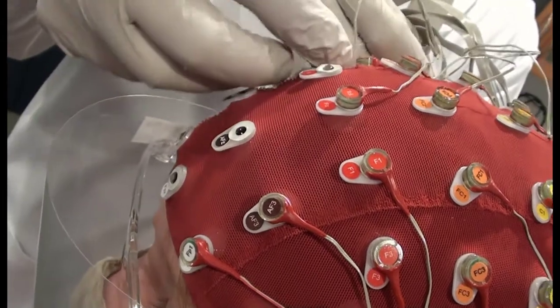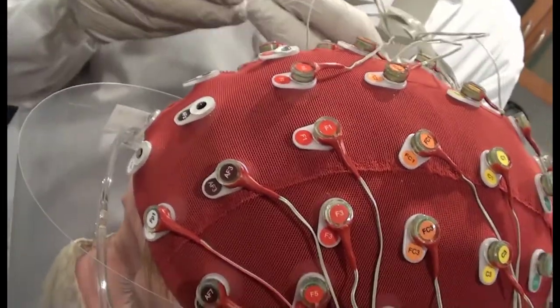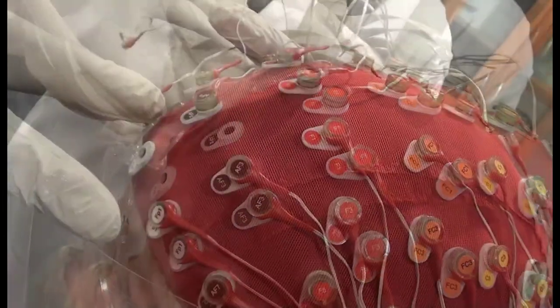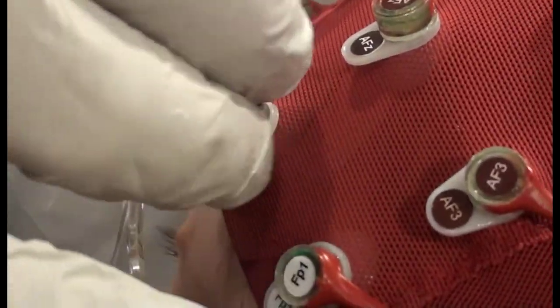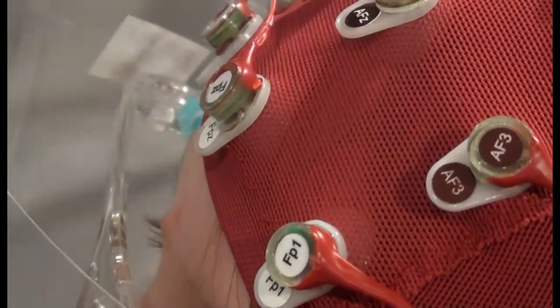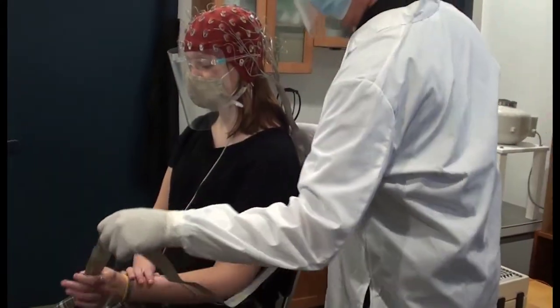As you finish with each electrode cable, put the cable over the participant's left shoulder so that all the cables are in one place when you're finished. Depending on your participant population, you might also want to make the participant aware that they are responsible for keeping the cables off the floor so that you don't step on them.